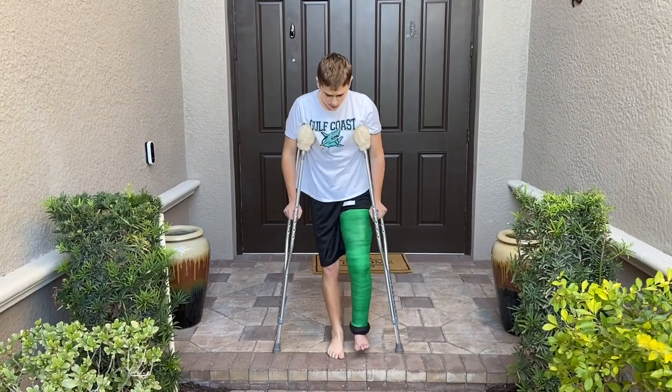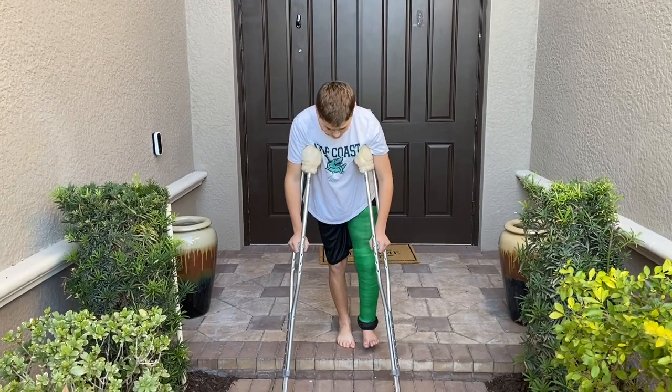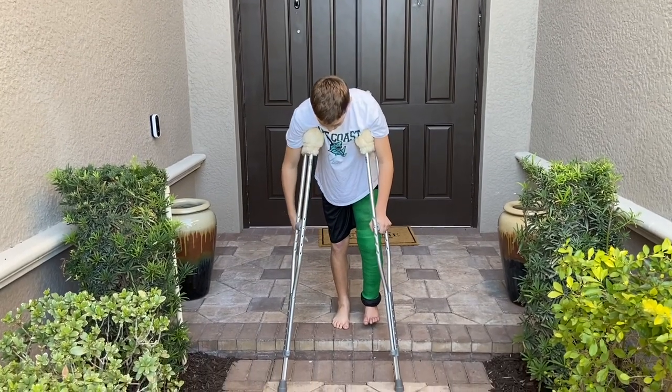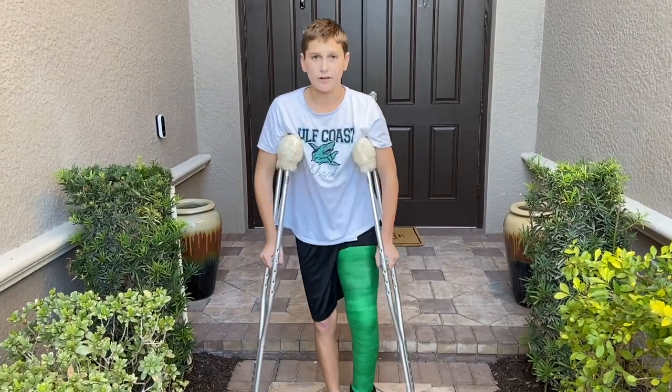When going downstairs, you don't want to do your foot first because you want to have that extra support. You want to put the two crutches down first while you still have that one foot on the upper step, and then you just go down like this — very simple.